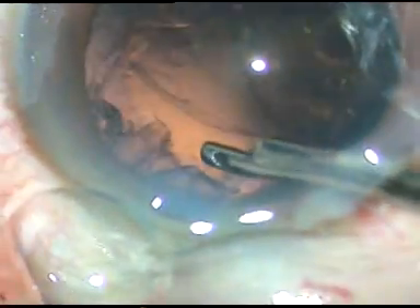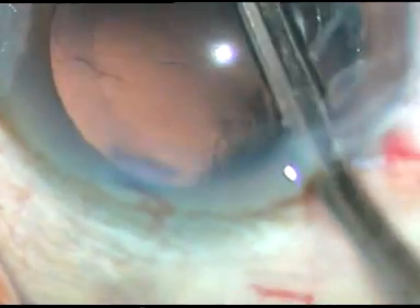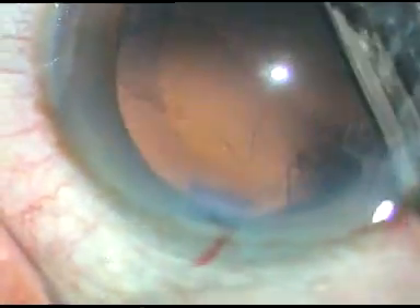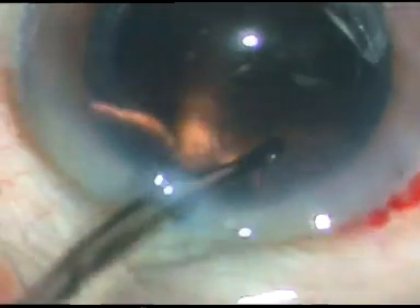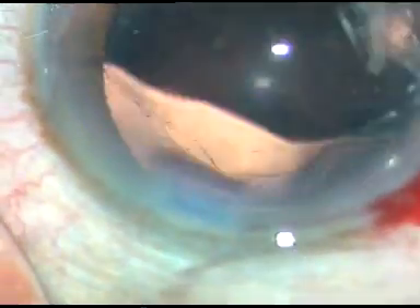Now cortical cleanup is being done with the Simcoe cannula. I have only one side port and I can't use bimanual irrigation aspiration. So the cortical cleanup has been done nicely. A little bit of polishing of the posterior capsule is done.